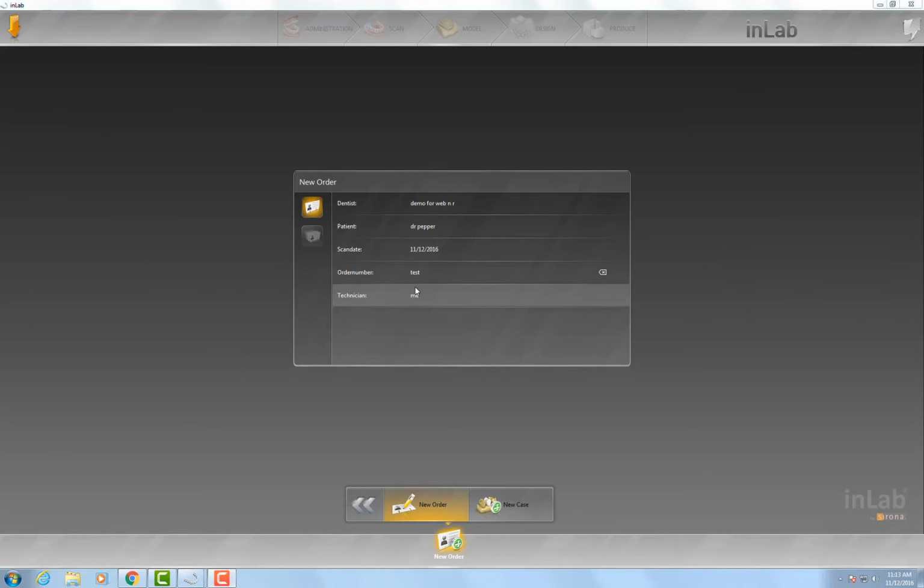We started advertising this software after we found our manufacturing methods, and our fit and precision is starting to bring us a lot more new accounts. Our R&D and our technology mean the doctors are getting new products that other labs can't produce because they haven't had this education that y'all are getting today. Hopefully this will give you the advantage you need to download the IPF software and give you a really exciting experience into what you want to do to introduce or streamline your IPF software department.